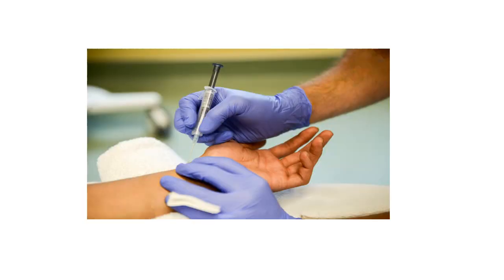Good evening, everybody. Today we are going to discuss a very important topic, that is ABG analysis. So first of all, how to take a sample. When you take a sample, take a syringe of around 2 to 3 ml. Take a small syringe. Along with that, heparinize the syringe.